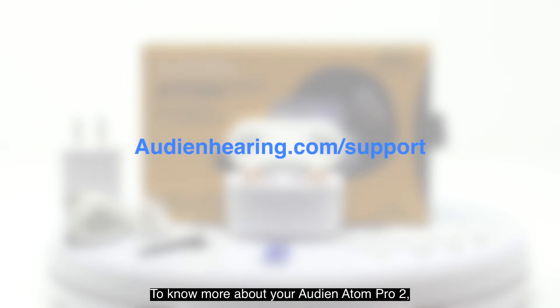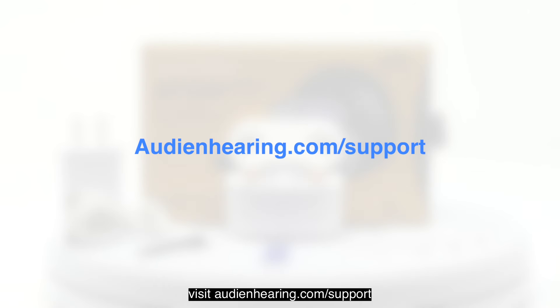Within the charging dock, you'll find a hollow section designed to house the Audien Atom Pro 2 units. Place the earbuds face down into the hollow section, ensuring the removal wires are not bent and the connection is secure. The devices will magnetically connect to the charging dock, and you should feel them click into place. The Atom Pro 2 has two sets of lights — the lights on the front of the case indicate the charge of the charging case.